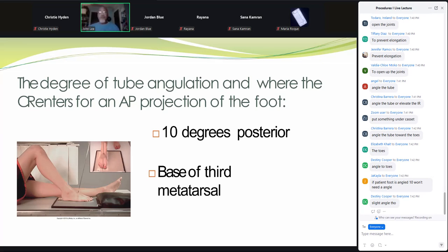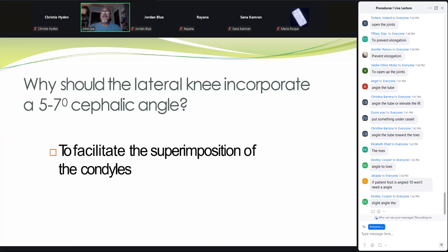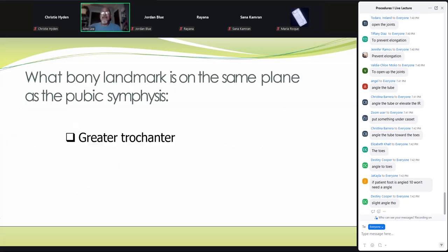As far as adaptive radiography, we're not always going to be able to sit at 0 and then count to 10. We're going to have to put it at a certain spot and then maybe go to 10. You'll see that next week when we talk about the skull. That's going to come in handy. That was a good slide to stop on, though. So we'll go through quite a bit of these, like I said.